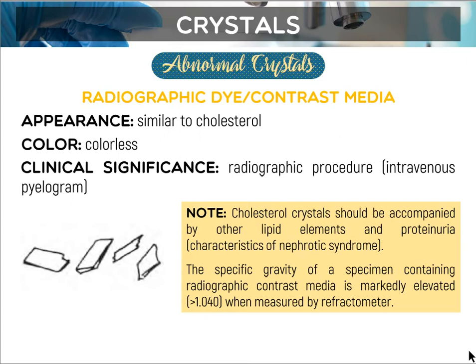So take note, cholesterol crystals should be accompanied by other lipid elements and proteinuria, right? As I said earlier. And then the specific gravity of a specimen containing radiographic contrast media is markedly elevated, so greater than 1.040 SG when measured by a refractometer.